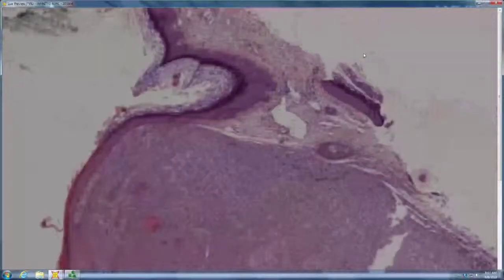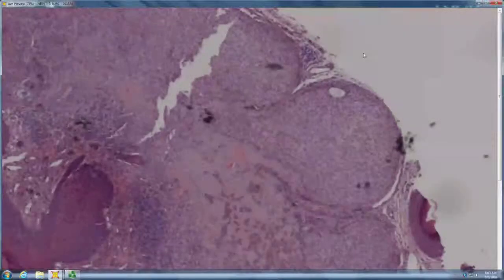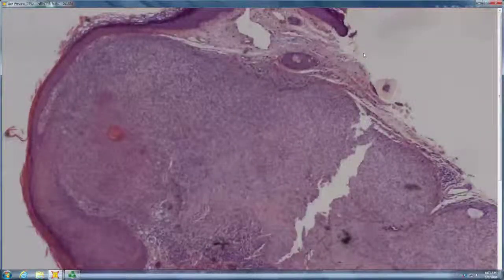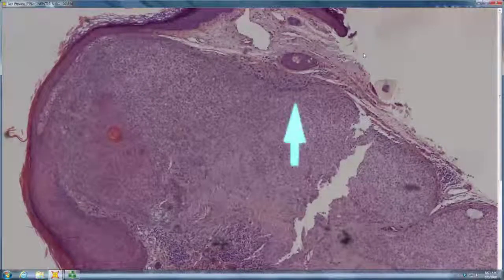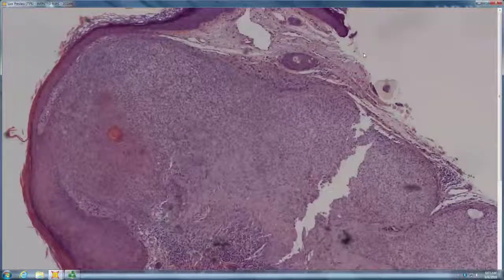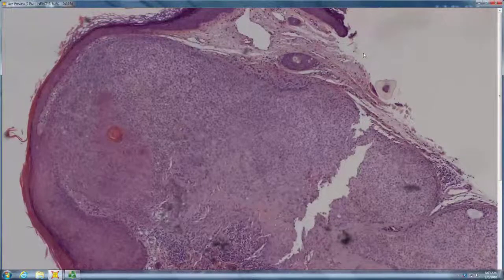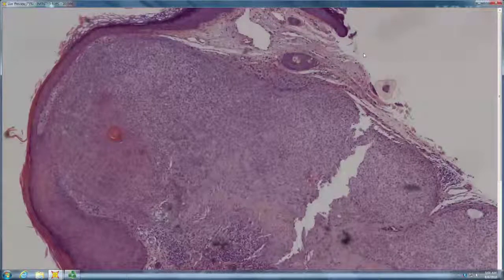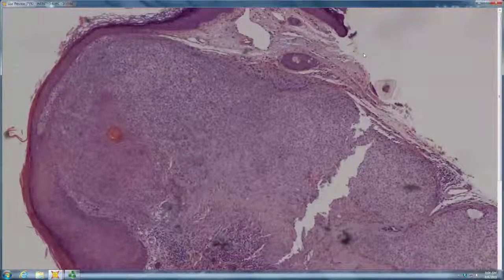Okay, how about this? So, desmoplastic trichilemmoma. So why is it a trichilemmoma? Like really clear cells hanging off the... So lobules of clear cells hanging off the epidermis. How does it differ from a clear cell acanthoma? So, clear cell acanthoma is like super well demarcated and more... Does it hang off the epidermis? No. It kind of is the epidermis, right?